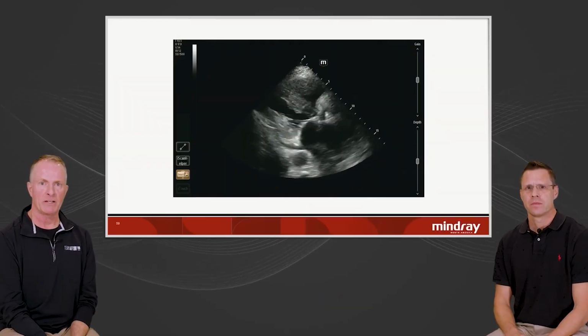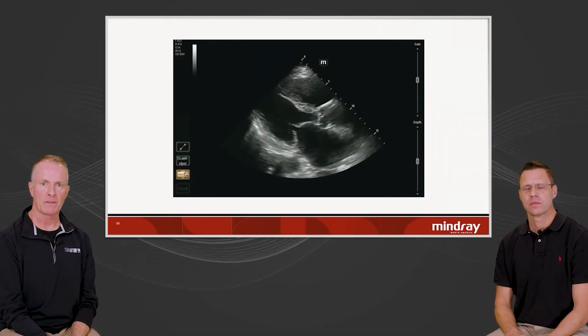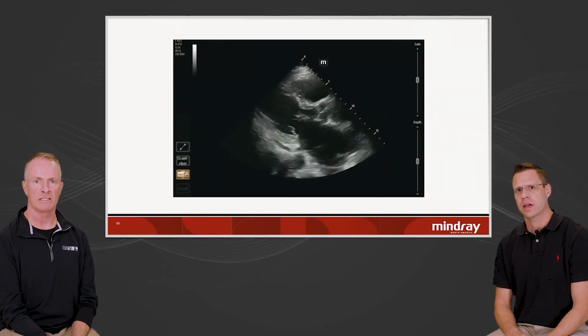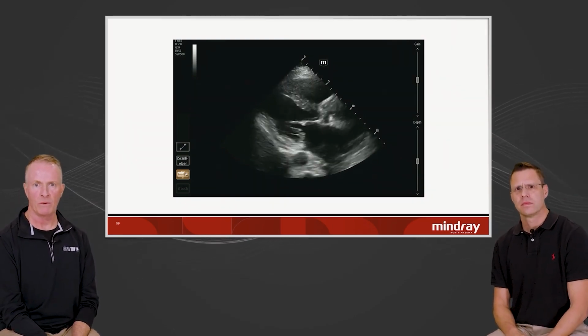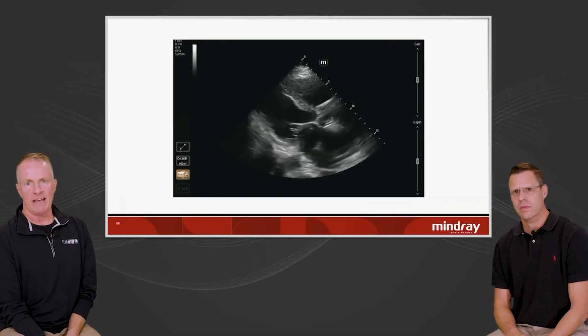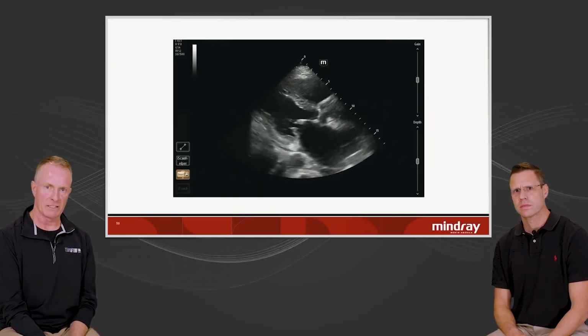Okay, now here's a patient who might show up with pulmonary edema, and looks like pretty reasonable left ventricular function, at least if you judge by glance, EPSS there. You can't see the apex, but still. What's the one thing you notice here is that the left atrium is huge, right? So that's a tip-off to diastolic dysfunction.